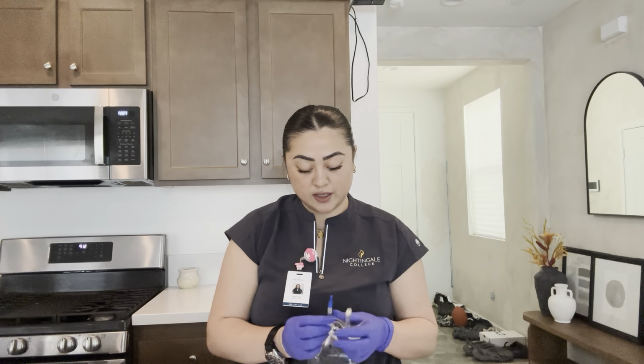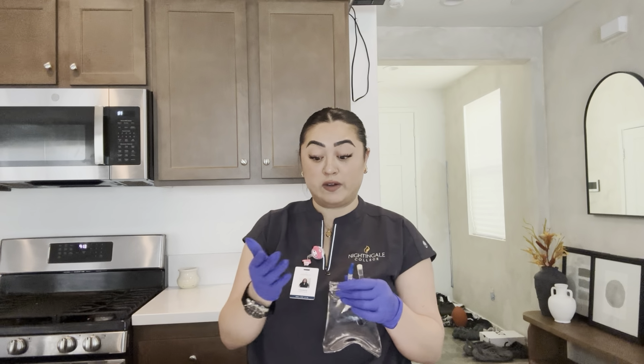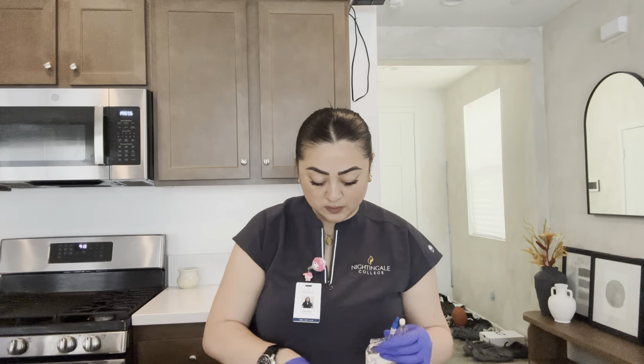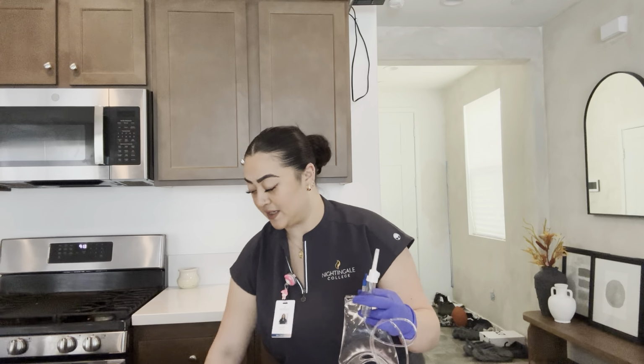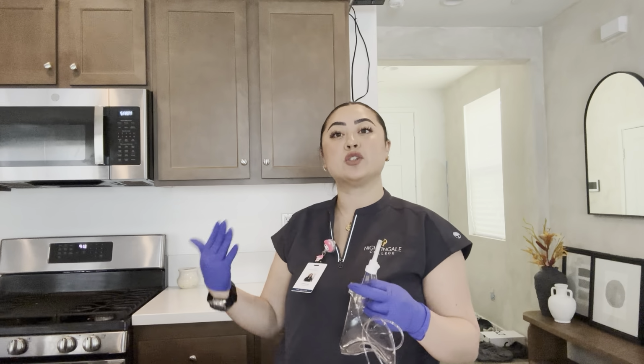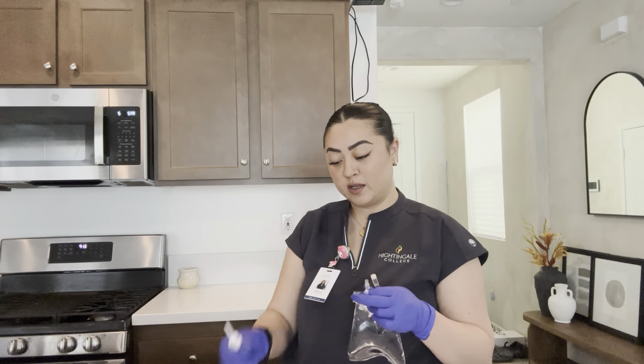Okay, so first thing that I'm gonna do here, I already verified the patient, and I make sure that there's no allergies. I know right now I'm just doing the fluids, but it's always good just to practice that for safety reasons, to review, to make sure that the patient doesn't have any allergies. So I have a bin down here. I know you can't see it, but it's where I'm going to be priming to ensure that there is no air. So I'm gonna go ahead and remove the top here.